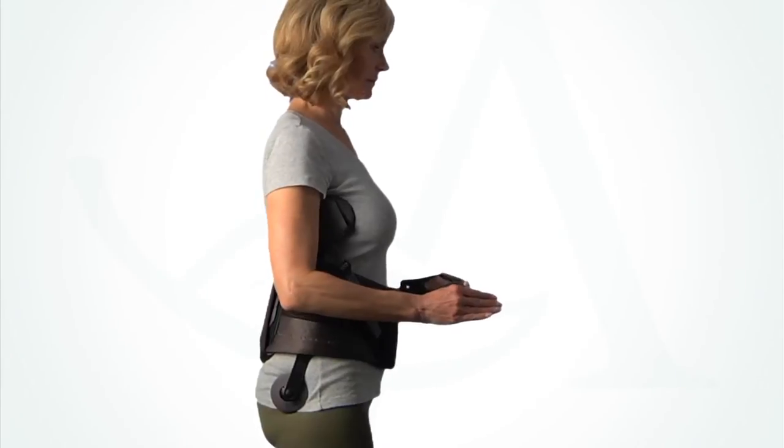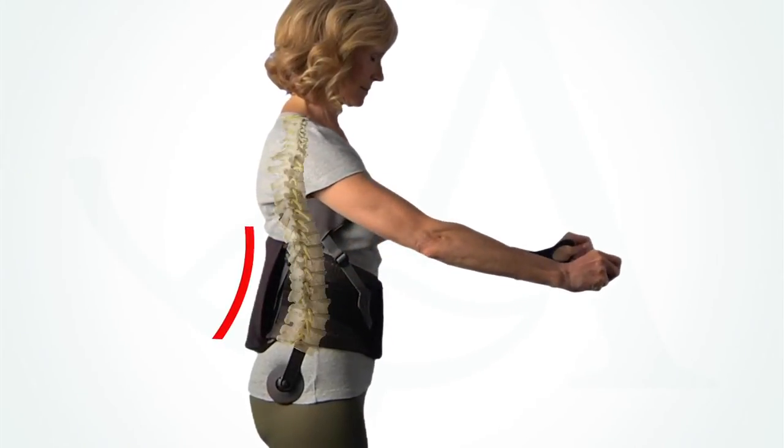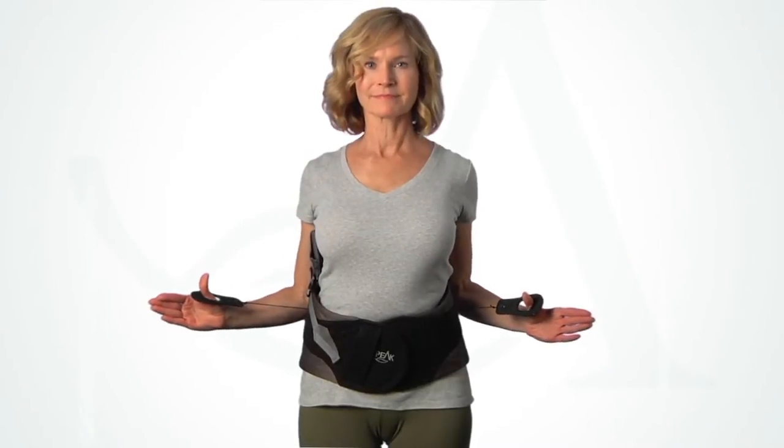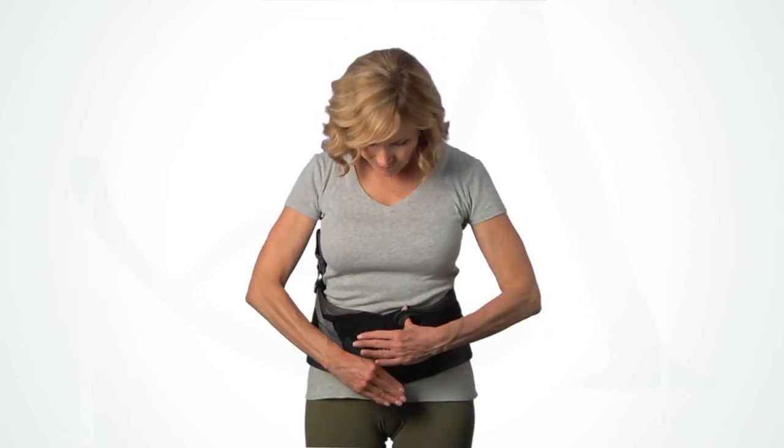As the compression is tightened, the self-adjusting back panel contours automatically to the lumbar spine. Once the appropriate compression is obtained, place the pull tabs on the front panel and press down to secure.